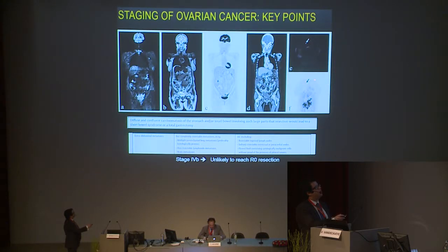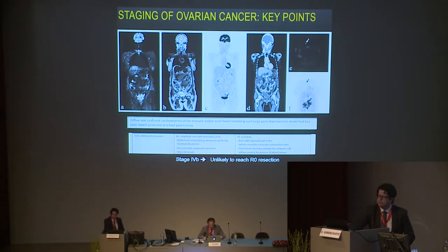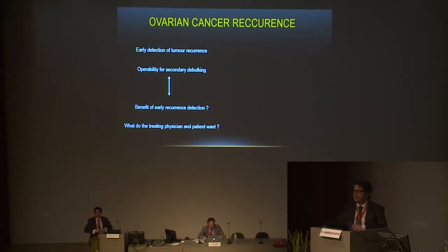So here we have the hypermetabolic lymph node along the mammary chain, and there's really a very bright node on the diffusion MRI of actually 6 millimeters. So we can see truly small disease. And also here in the patient, because she was not just inoperable because of this lymph node, but you can also see the diffuse disease spread. And this is one of the major strengths of diffusion MRI.